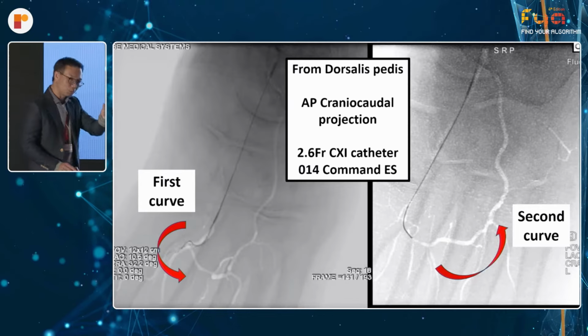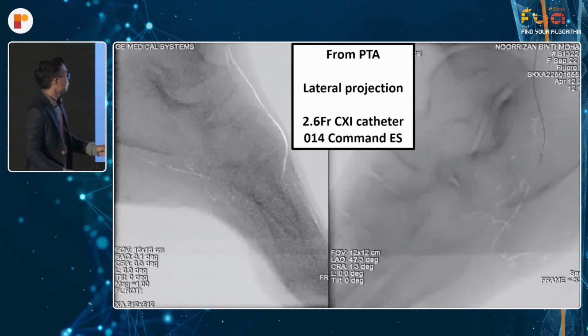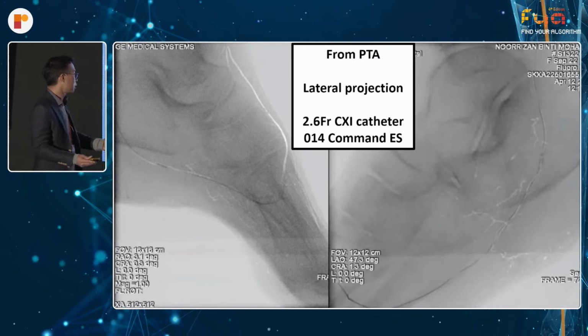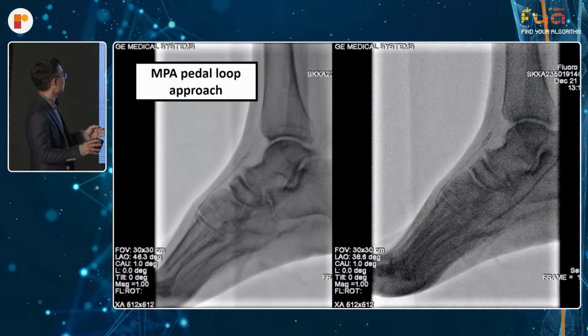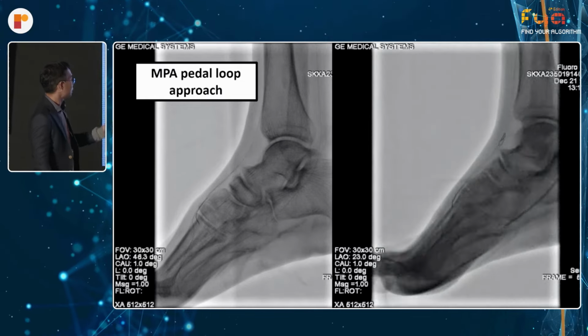And from there, you should be able to negotiate yourself around the plantar arch. In my experience, for the PTA, the lateral projection is sufficient to cross. And do not forget, there's also another way to do the pedal plantar loop through the medial plantar artery.